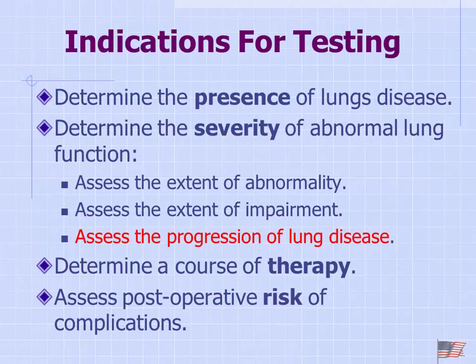All right, so why do we do pulmonary function testing? Primarily, we're looking for the presence of lung disease, but then also sequentially, we'll see what the severity is, and also the course of therapy. Is what we're doing for the patient doing any good? If it's not, why are we doing it? Or should we be doing something different in the process?